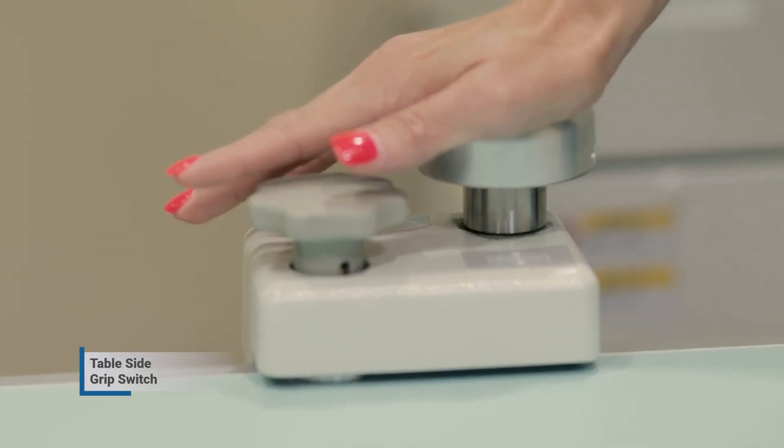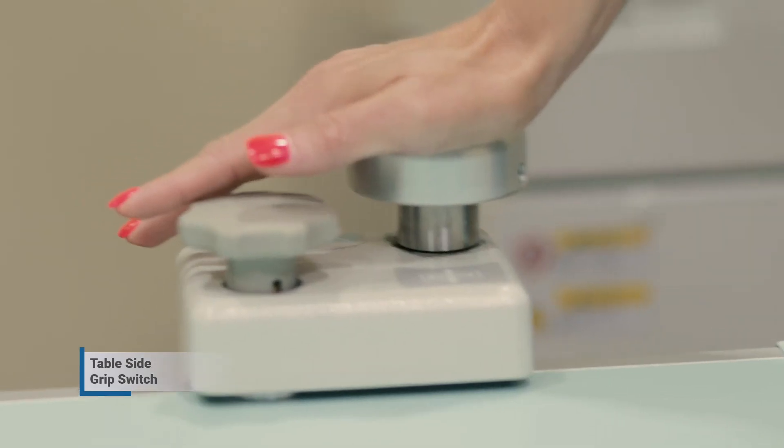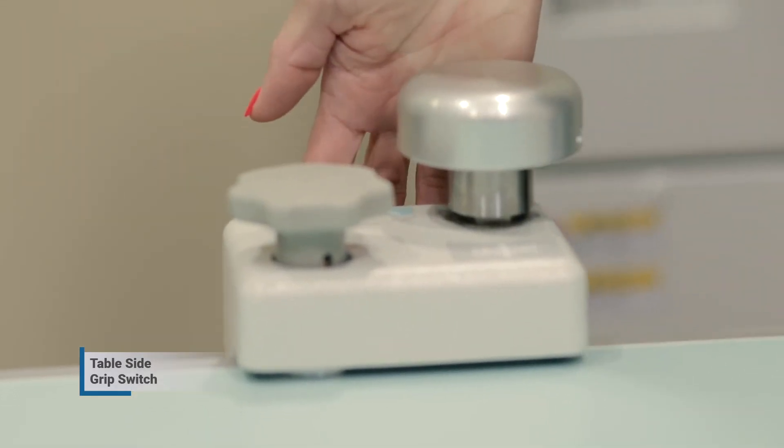The table-side grip switch allows the technologist to manipulate the tabletop in all directions from the back side of the table, as well as lower and raise the table.